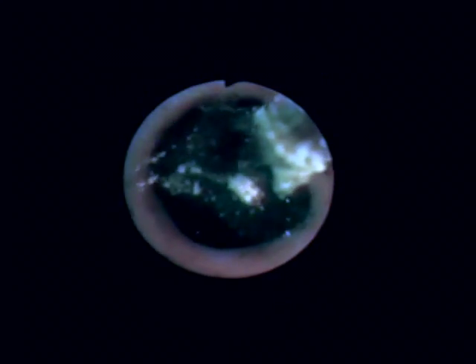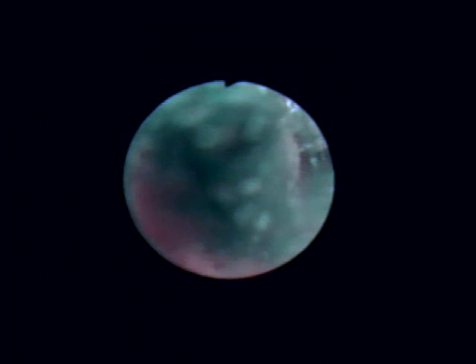This black-colored stone has a very hard outer shell, and it is not easily fragmented by several EHL firings. Although the targeting seems to be appropriate, reddish bile duct wall injury is developing at 10 o'clock position by repeated generation of shock wave. In this situation, my approach is to target only one point of the stone repeatedly and reach the inner core as early as possible. After exposure of the inner core of a stone, further lithotripsy becomes much easier.